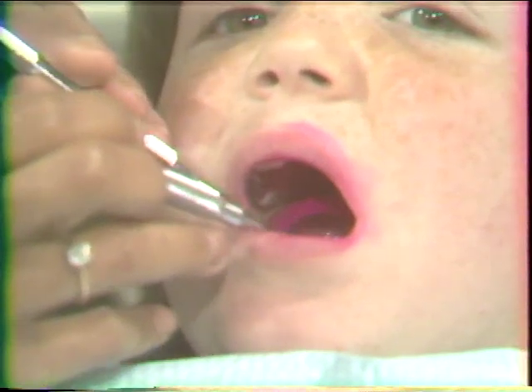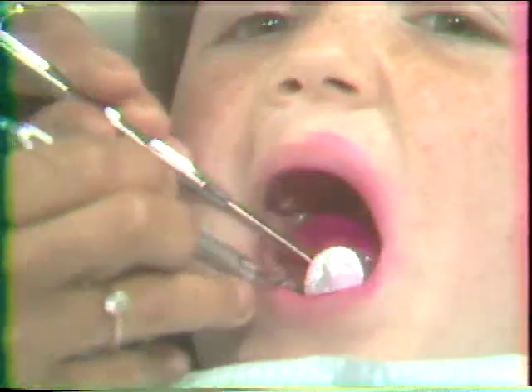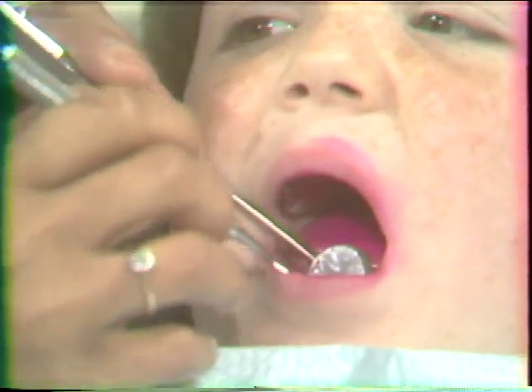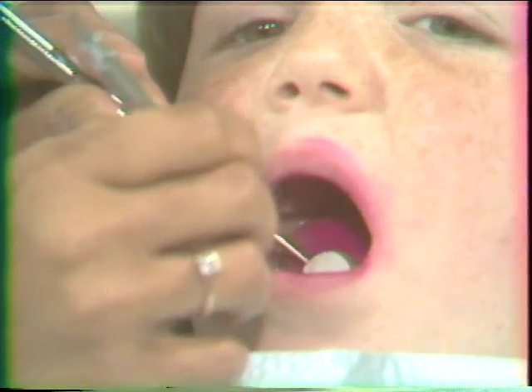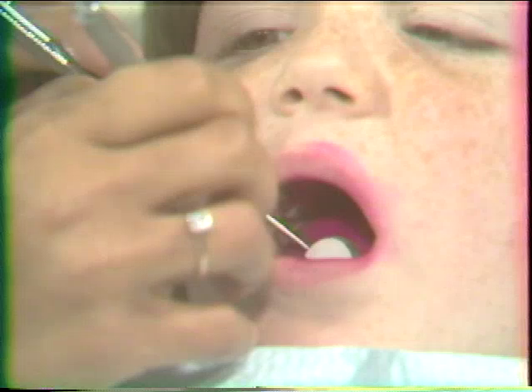The cutting edge engages the supragingival calculus at the level of the crest of the gingival margin, and the calculus is dislodged with a firm, steady motion upward toward the crown. The procedure is systematically repeated until all the visible calculus is removed.